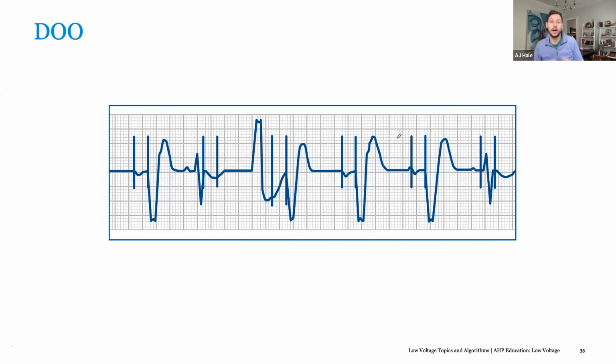No, that's great. So Dr. Daffy, if you haven't used it yet and you'd like to use it for a patient, for example a small patient where you're worried about screwing in an active helix, or about forward pressure from a passive fixed lead, you may consider this. Clinically, I would think the advantage is you don't have to worry about an atrial perf risk. And if you're worried about them becoming occluded later in life or developing SVC syndrome, it's one less lead to take up any space. So I think it definitely has its advantages.